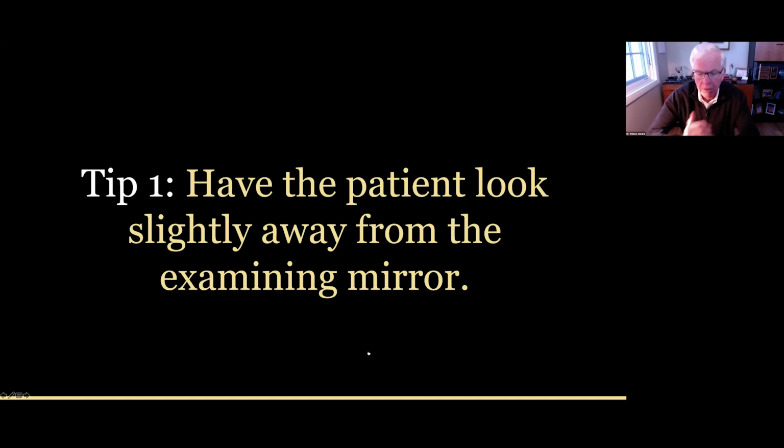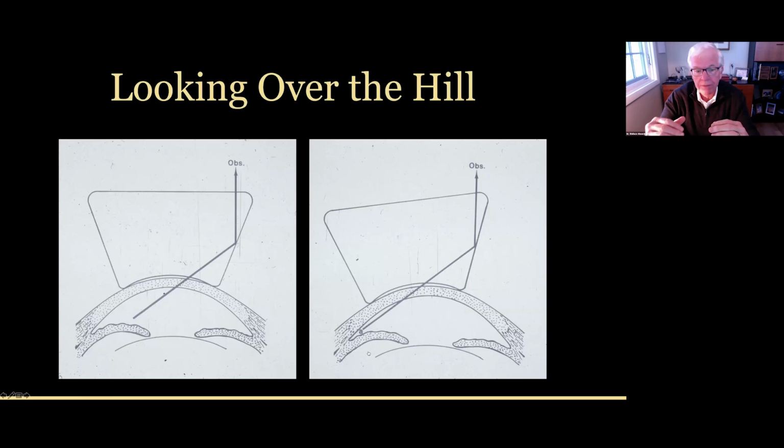When people in the questions that you send in were asking about looking over the hill, which used to be part of this lecture, because in the past, when we had people on pilocarpine, they would have some relative bombe, but their angle wasn't closed. But you had to kind of look over that bombe to see the angle. So to do that, you would have them look into the mirror. And so by having them look into the mirror, I'm now looking up over that hill into the angle. Since we have virtually nobody on pilocarpine anymore, I kind of dropped that from this lecture. But it's the same concept.